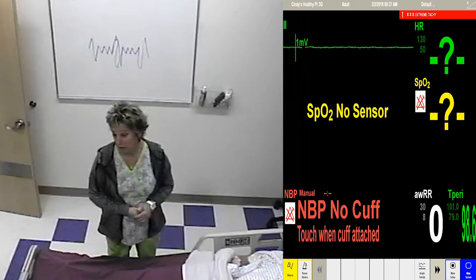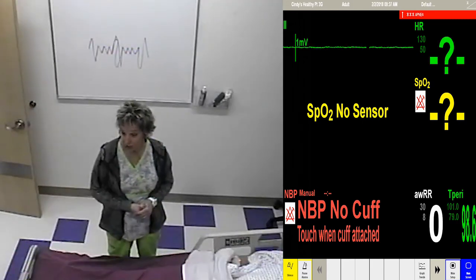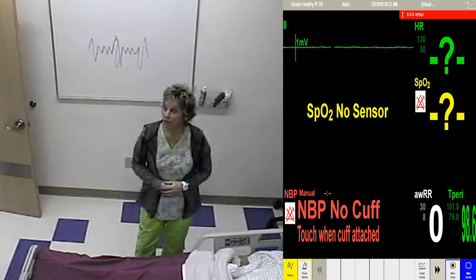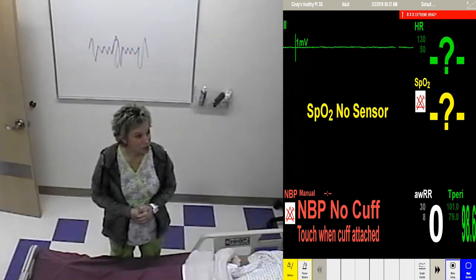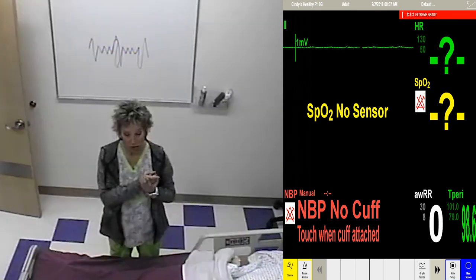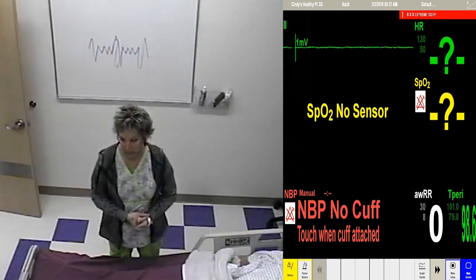Or you need to check leads. Excellent observation. You do need to check leads. Have you ever had a patient who looks like this and they say, what's going on? Okay, that's a good sign. We're happy with that. But asystole, he has no heartbeat. Got it? Well, do we shock this one? No, just medications. You'll learn that later. Take ACLS.